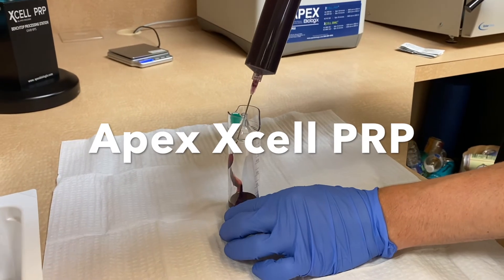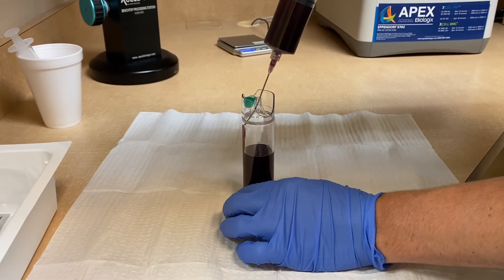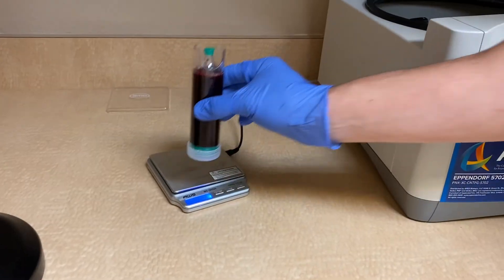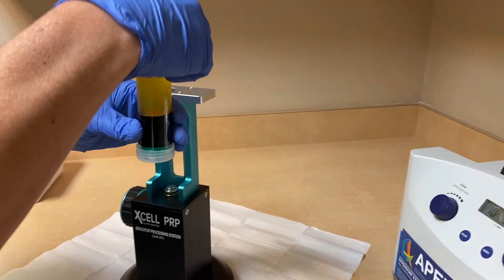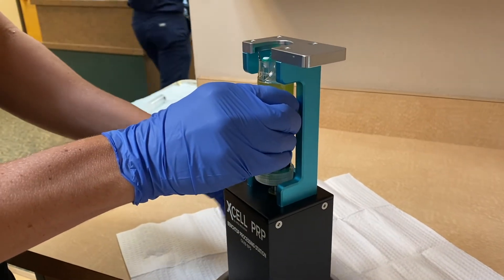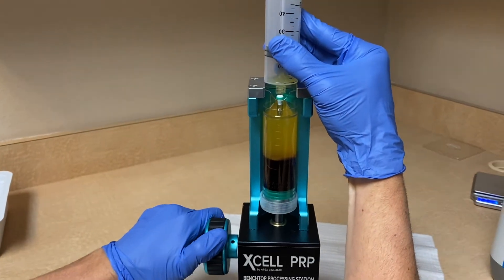Up next is the Apex XL PRP — a single spin collecting system. You can already notice after the single spin the plasma is quite a bit more clear, with less red blood cells.